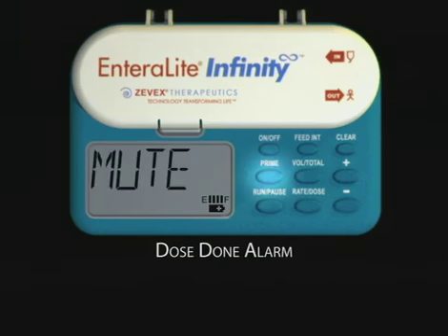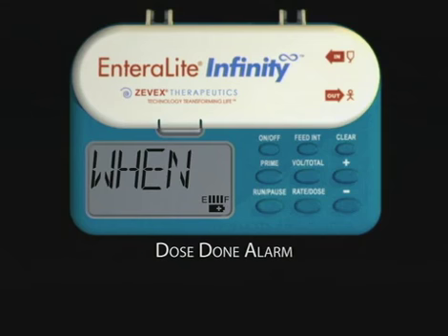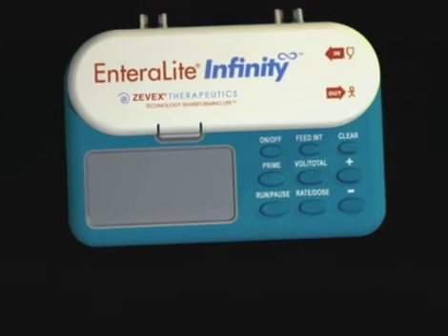Press the prime key again to adjust the dose done alarm. Press the plus key to change to beep when done, or the minus key to change to mute when done. Press the prime key again to adjust the backlight feature. Press the plus key to change to light on, or the minus key to change to light off. When light on is selected, the backlight will remain on when the pump is running on AC power. The new settings will be saved automatically when the pump is turned off.